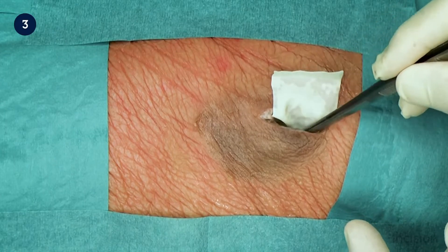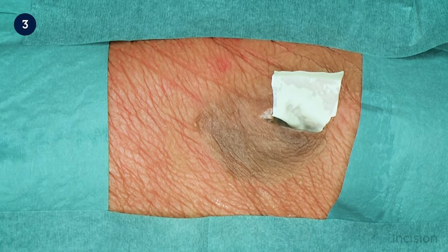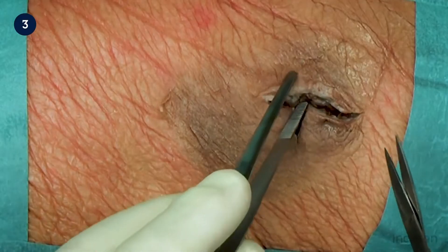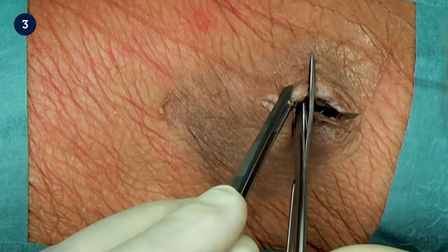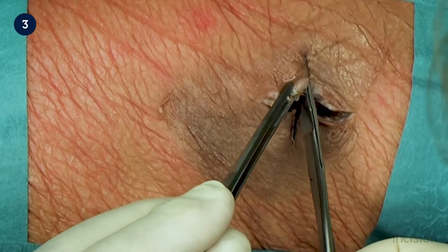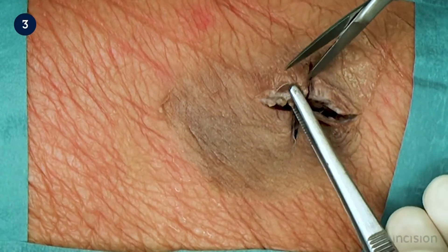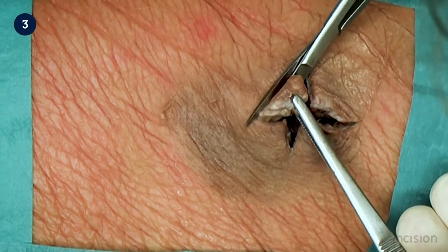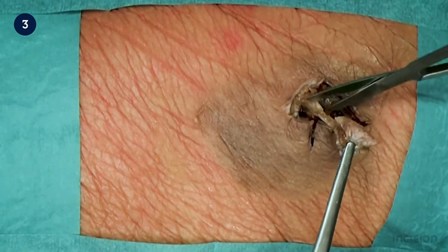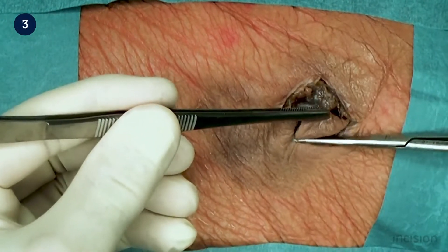If more comprehensive drainage is indicated, the incision can be extended. Here, a cruciate incision is made using scissors, by placing two cuts perpendicular to the margins of the original incision. The corners are then trimmed, as this will permit better drainage and, if left, the corners may necrose and delay wound healing.